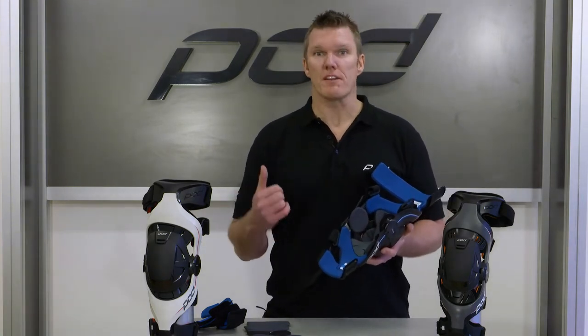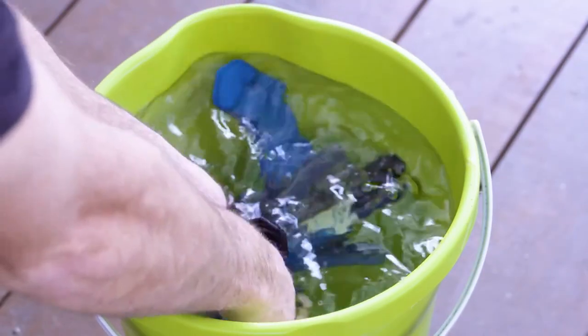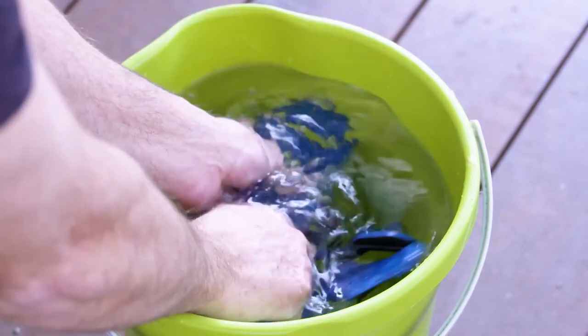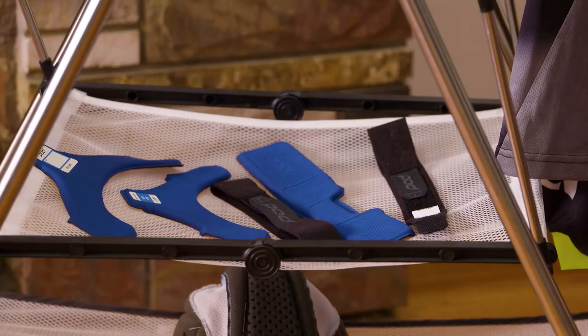You can pull all the padding out — it very simply un-Velcros. Stick it in the wash. You can wash it without detergent, or you can use soap, but nothing with chemicals. What we encourage is to just put it in a bucket of warm water, wash it, and let it air-dry with just ambient air temperature.